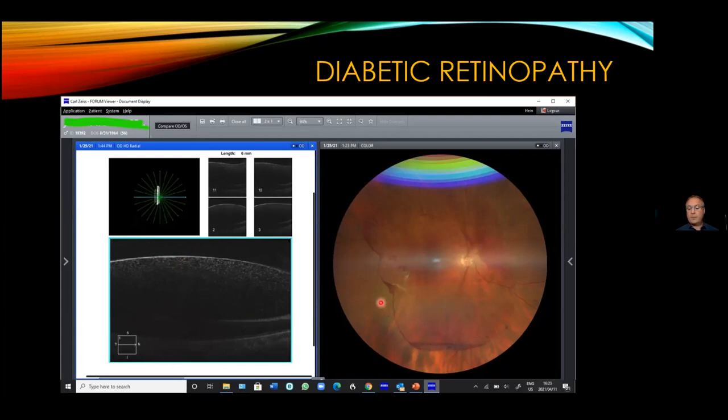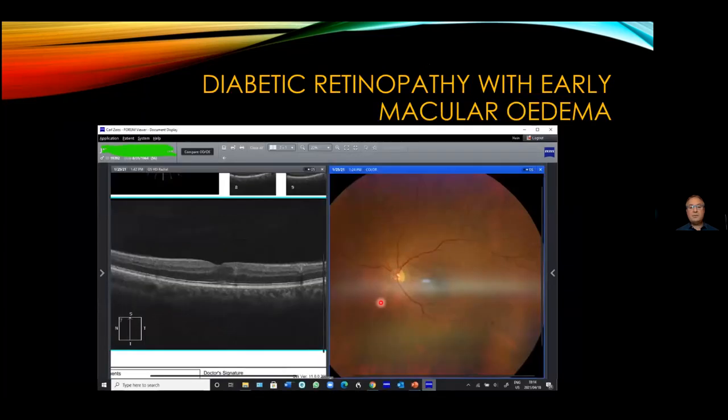Now, with experience, we always have to examine the patient's other eye, because he said to me he had no problems in the other eye. And with further investigation, certainly he would have something there, and we can see that he's got blood hemorrhages, microaneurysms. I do not see any new vascularization of the disc or elsewhere, but he's got a start of macular edema. So there's a little red blood vessel there that's dilated and a small cystic area that's busy developing inside the macula there.